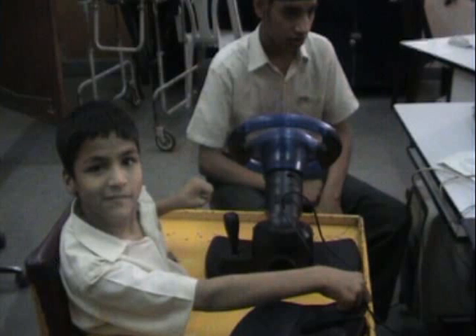And within a space of a few minutes, by having typed, "I am Arpit," he was able to show us that he had mastered handling the wheel in the simple art of typing.